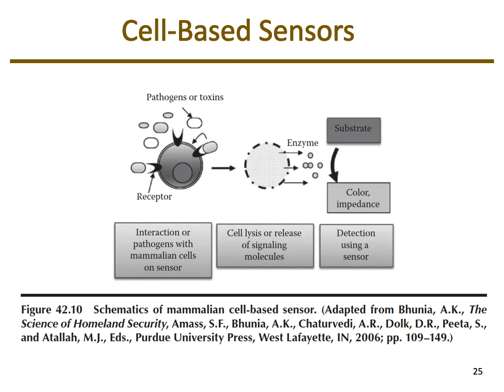They then release an enzyme or bioluminescence, and that gets detected by these sensors. The sensitivity levels of these are much higher than a lot of our other testing because it's simple ligand receptor binding, cell signaling pathways, gene activation, expression, so that you can then detect.